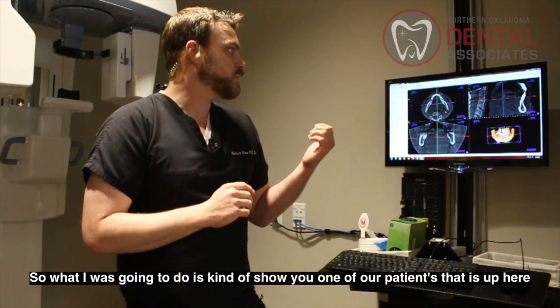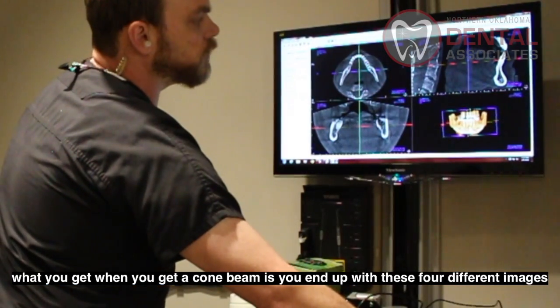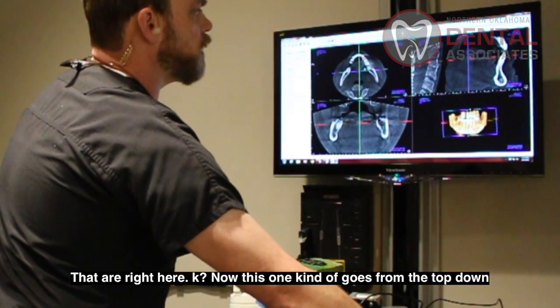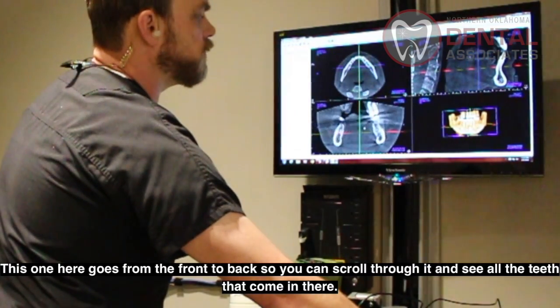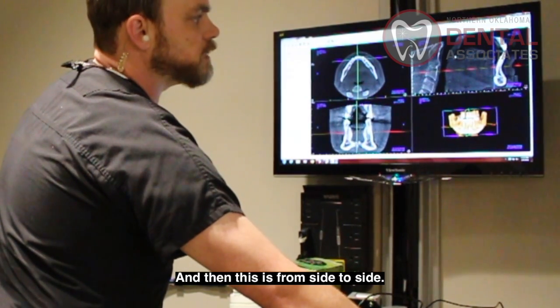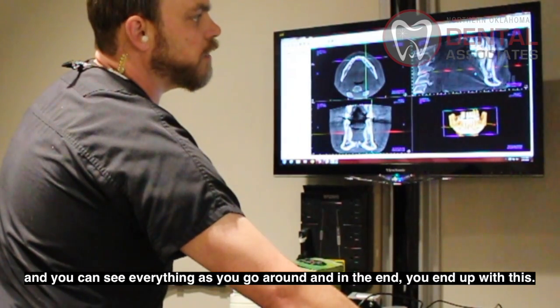So what I was going to do is kind of show you one of our patients that are up here. What you get whenever you get a cone beam is you end up with these 4 different images that are right here. Now this one goes from the top down through all of your teeth. This one here goes from the front to the back, so you can scroll through it and see all the teeth that come in there. And then this is from the side to side.